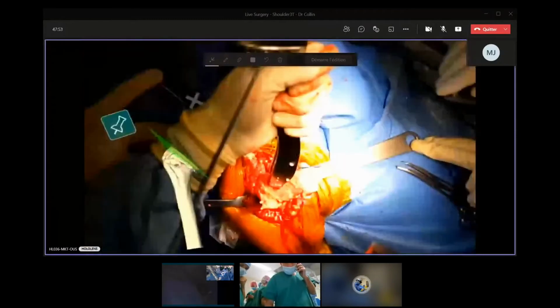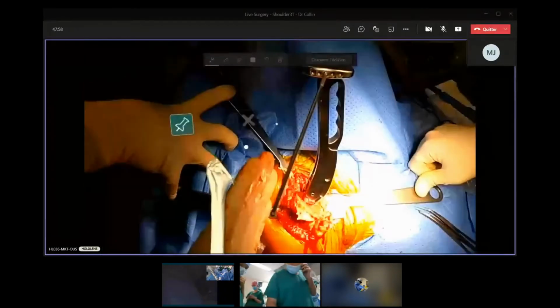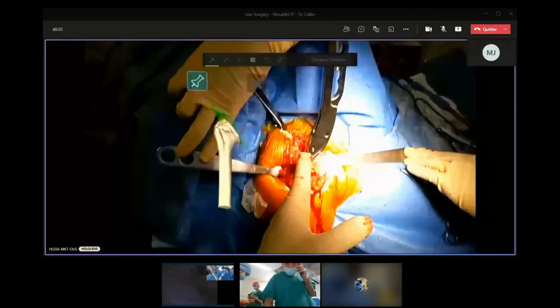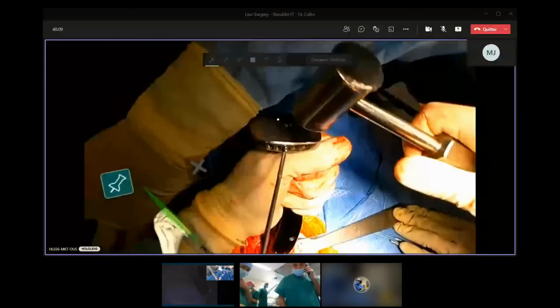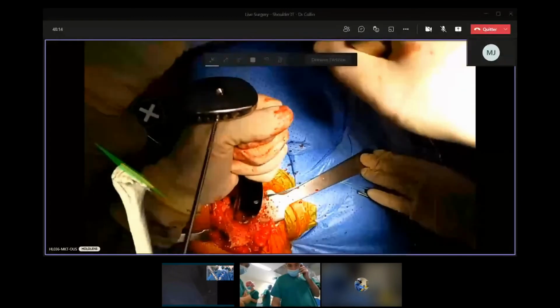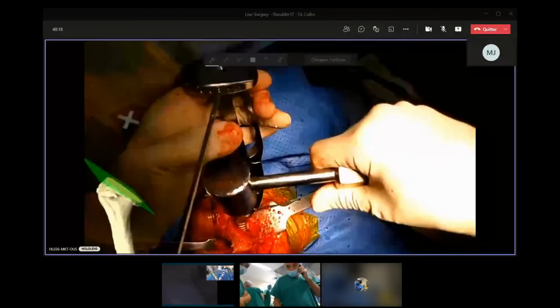Ok, here. I would like to teach that to you. It's a reverse shoulder arthroplasty, and you can decide your retroversion. Here, you see my hand. This is 20 degrees of retroversion, as you can see here. So you can do this. Perhaps not really more. The second one.